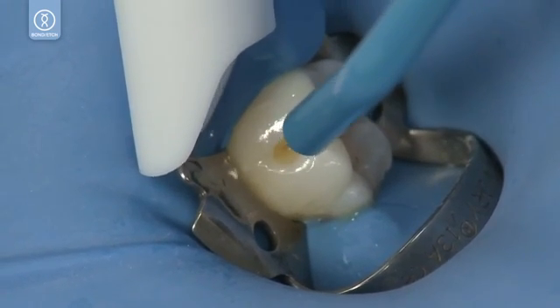Contour and finish the restoration with a carbide burr. Blend and polish irregularities with Jiffy Polishers, then complete the polishing process with a Jiffy High Shine Polisher.